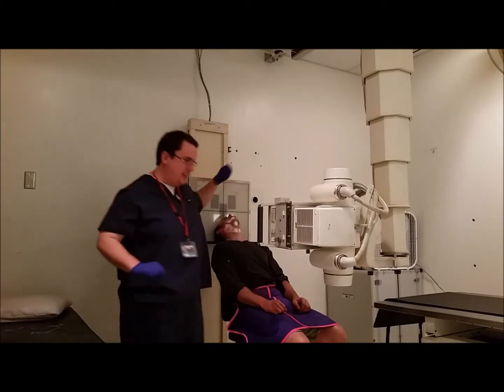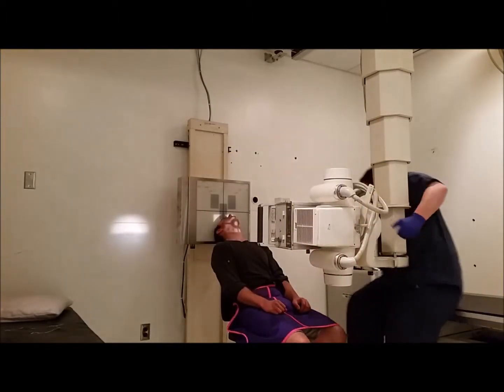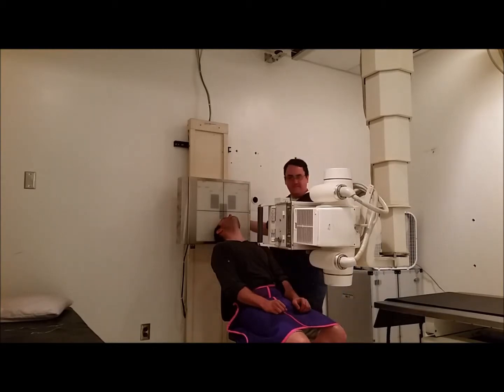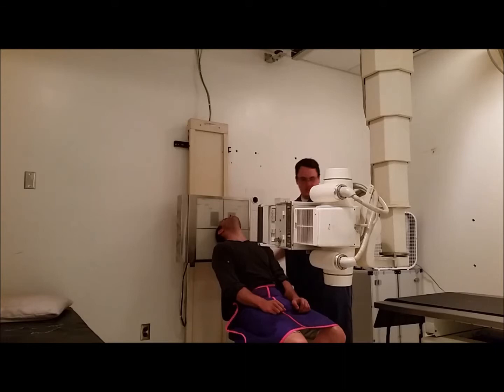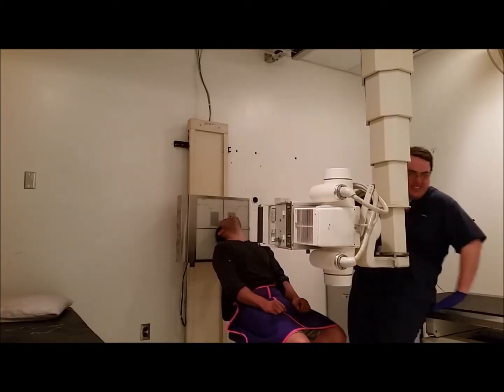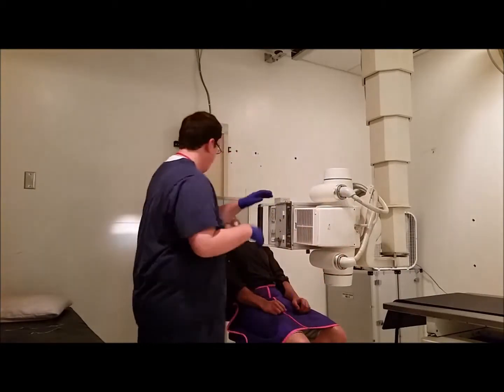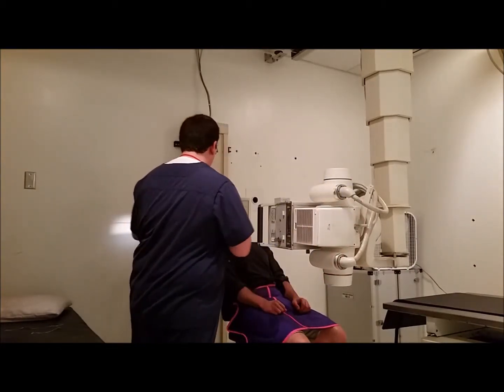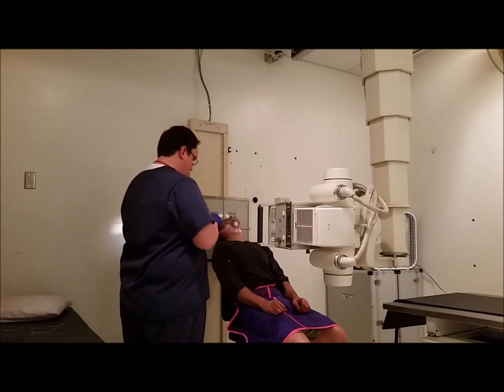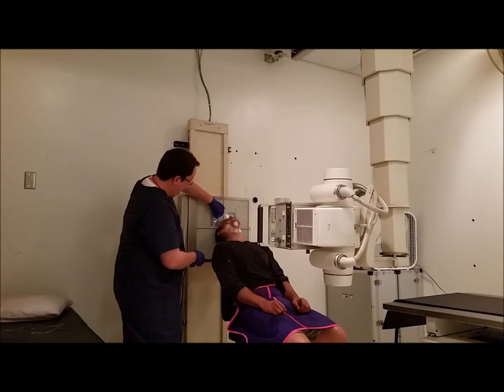Let's see. Just need to move the bucky down here. One sec. That's the view. All right, perfect. Get our marker up on there. Right side.